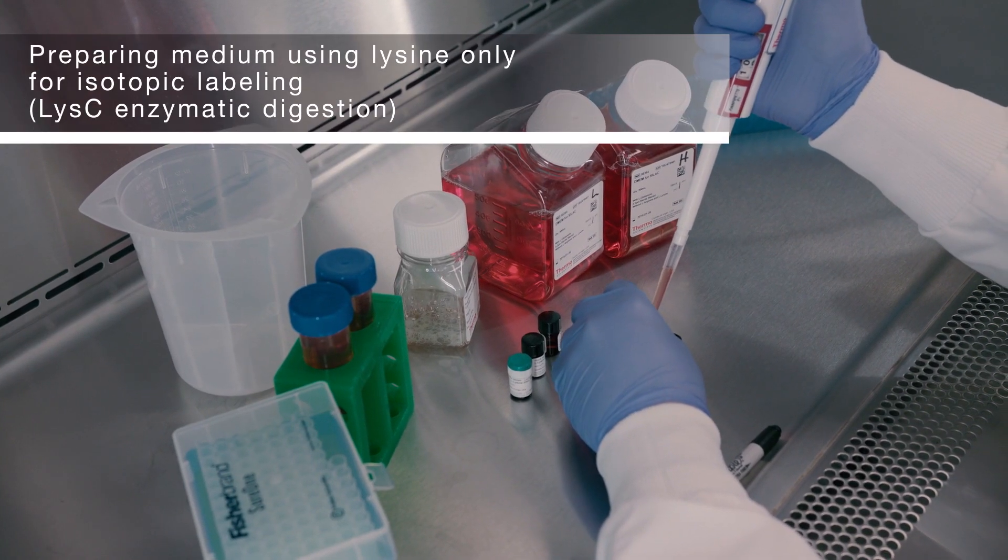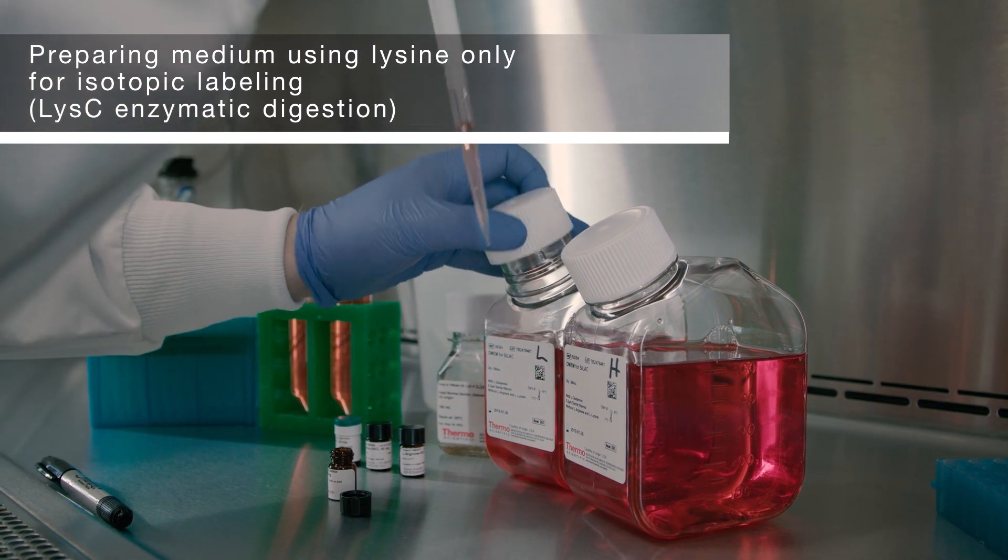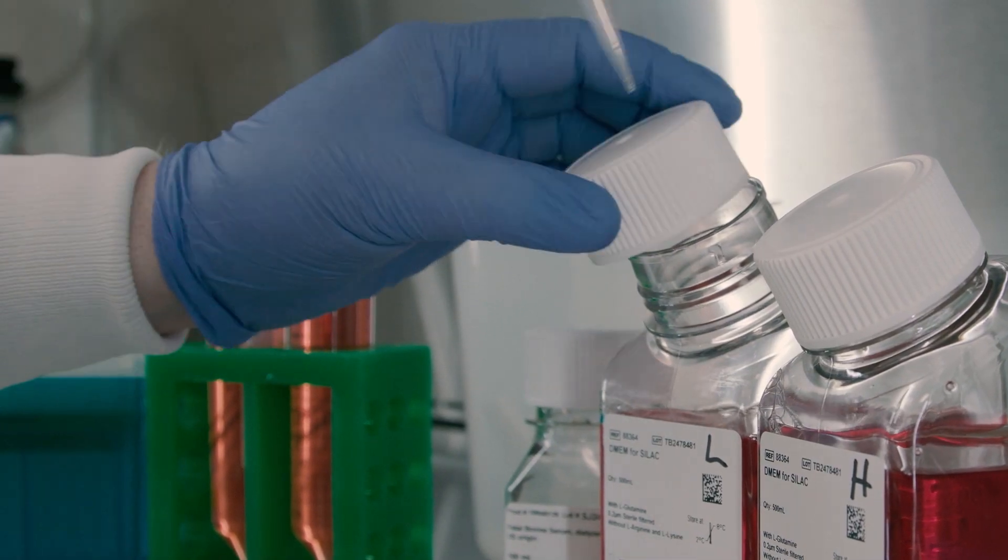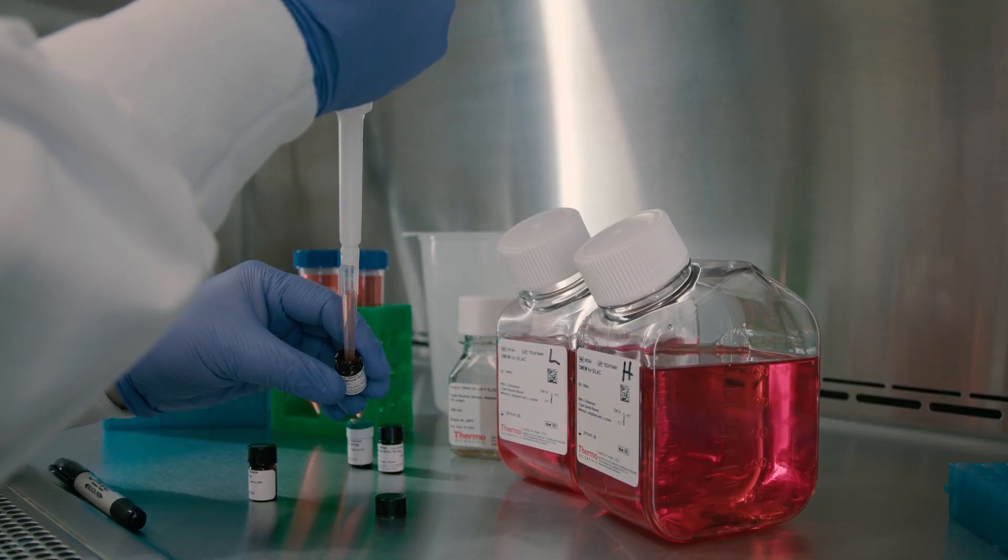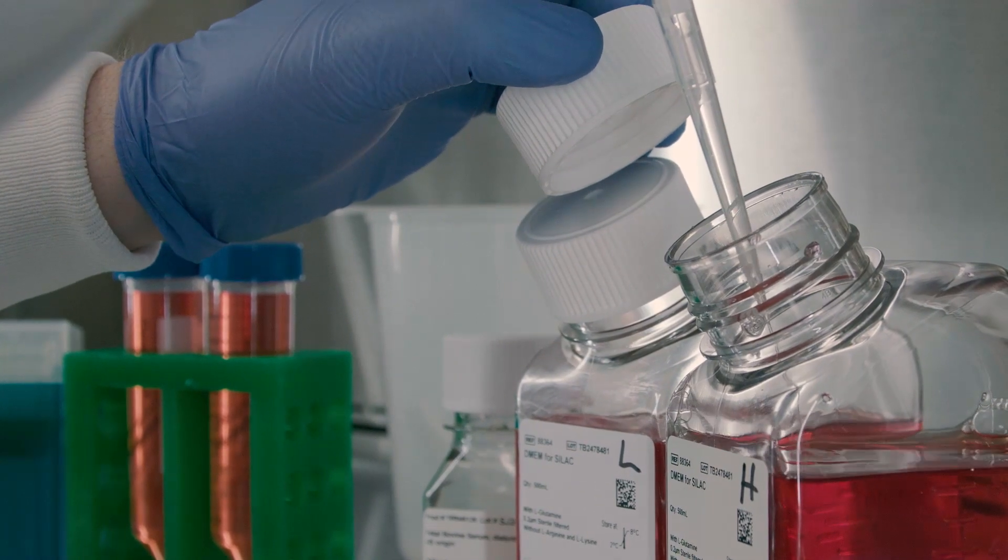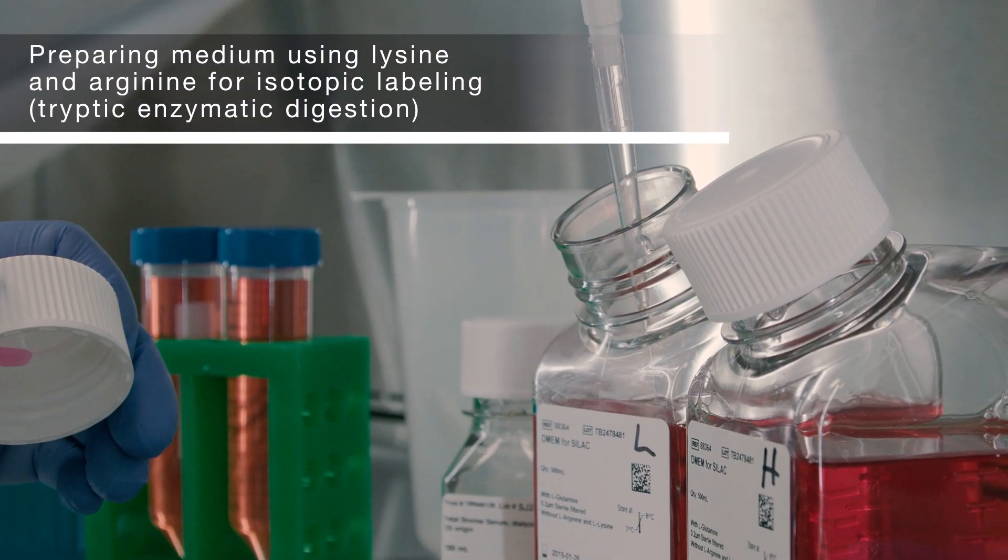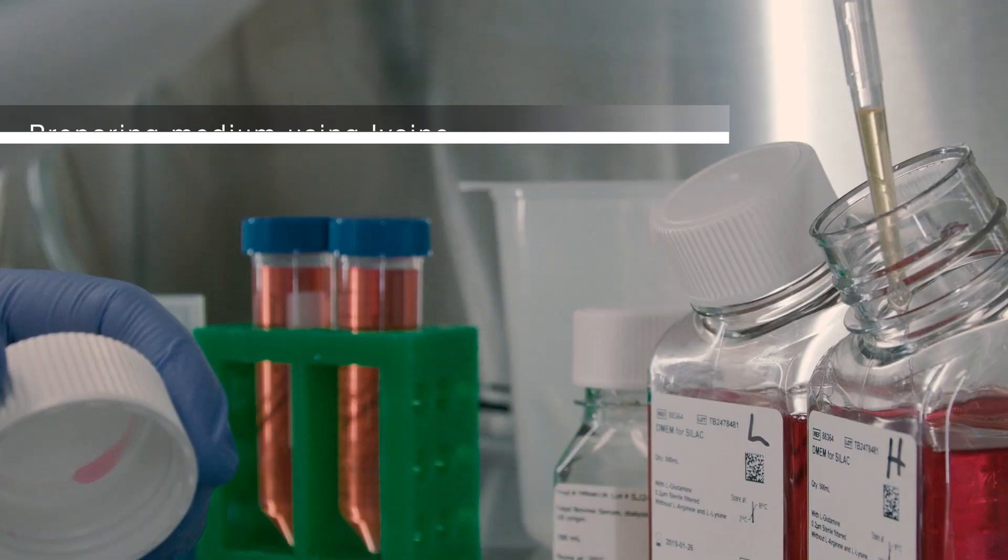For experiments using only lysine for isotopic labeling and subsequent LysC enzymatic digestion, supplement each bottle by adding 50 milligrams of the dissolved light arginine. Next, add 50 milligrams of dissolved light lysine to one bottle and 50 milligrams of dissolved heavy lysine to the other.